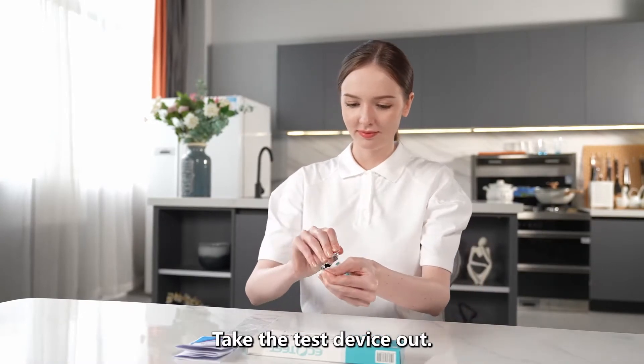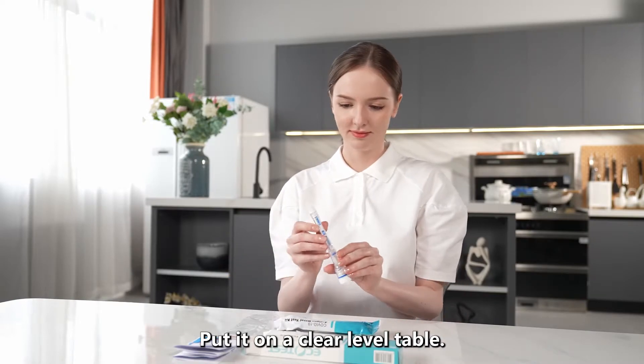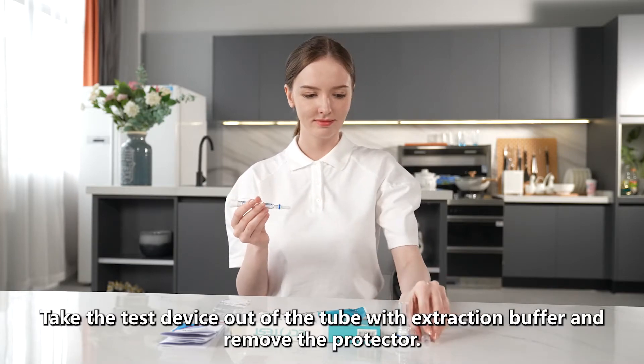Take the test device out and put it on a clear, level table. Take the swab out of the tube with extraction buffer and then remove the protector.